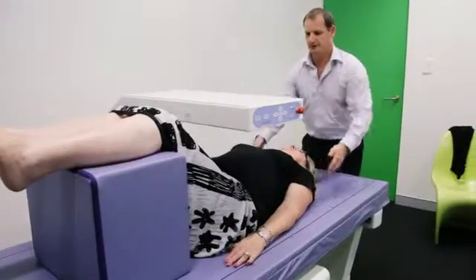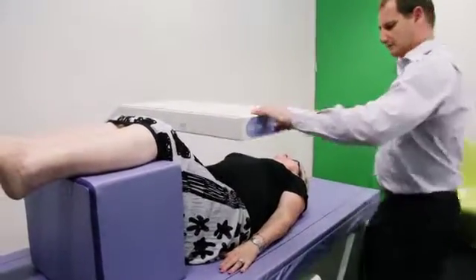As you've seen from today, the bone mineral density scans of the lumbar spine and proximal femur are simple, quick and easy to do. Our technicians here at MeasureUp, either in the city clinic or in one of our mobile vehicles, will do everything they can to look after you.